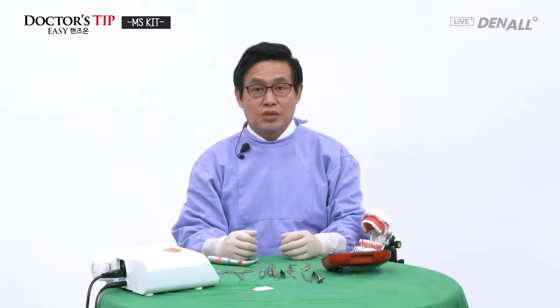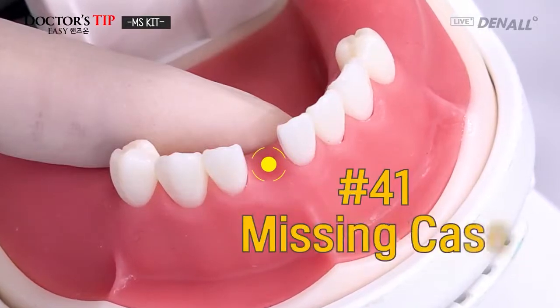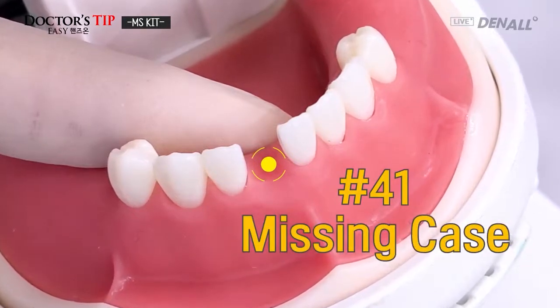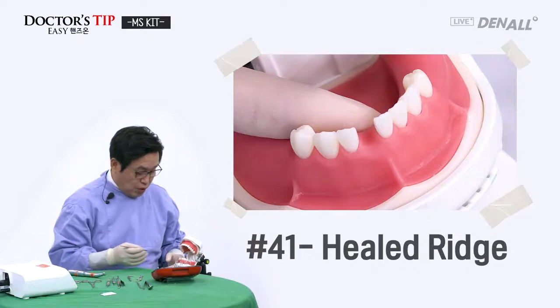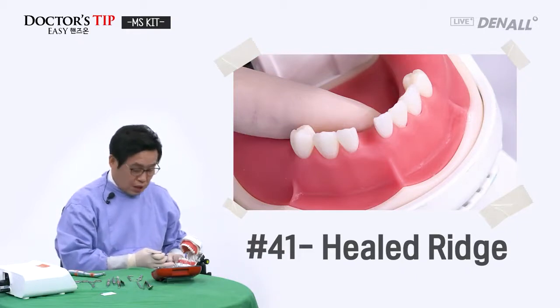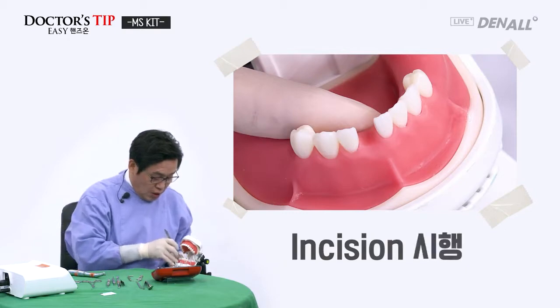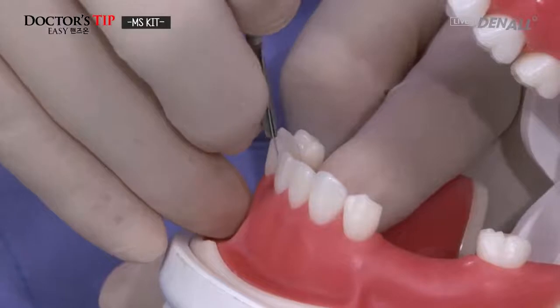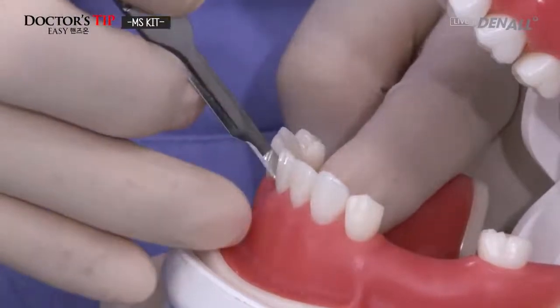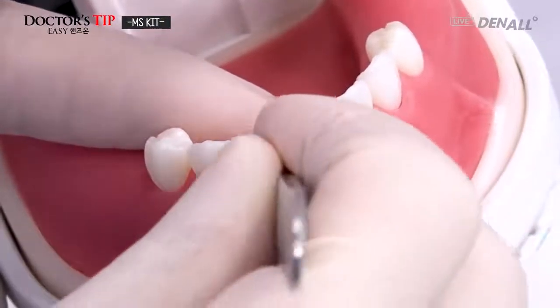So now I'll do hands-on for the MS kit. 41 is missing, and the 2.5, length 11 millimeter MS will be placed first in the missing area. It's been a while since the tooth was taken out, so it's a healed ridge. So I'll do a crestal incision toward the lingual side. To the adjacent teeth, I will release and open the flap.